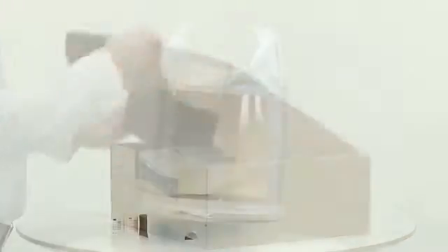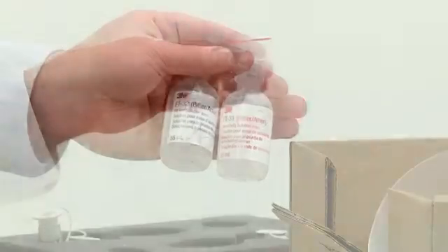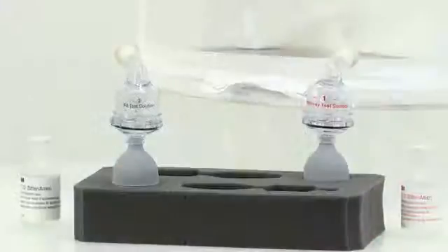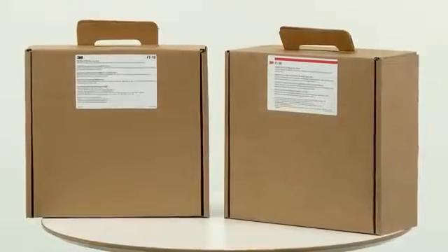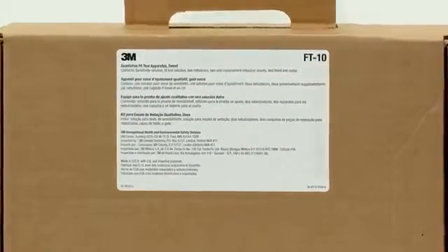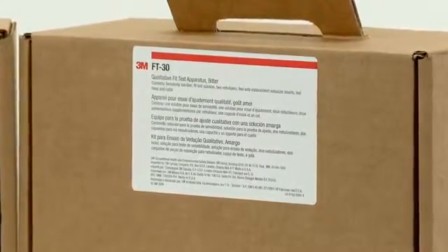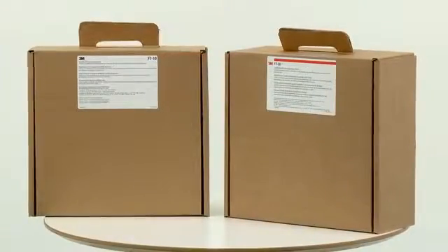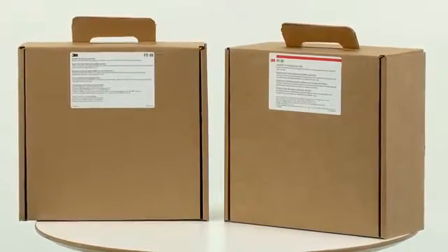The box contains a hood and collar, two nebulisers, two bottles of solution, spare nozzles and user instructions. Replacement parts are available if any damage occurs or the solution runs out. Two versions of the test kit are available: 3M FT-10 uses a sweet tasting solution and the 3M FT-30 uses a bitter solution. The two kits allow a choice to be made and provide an alternative if someone is unable to taste one of the test solutions.